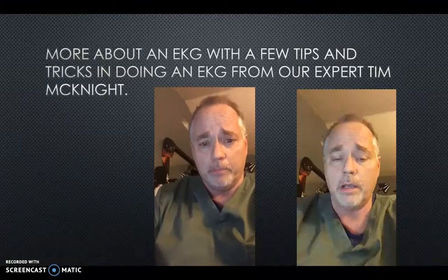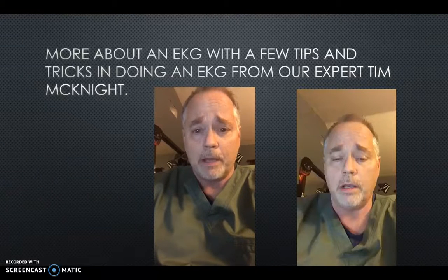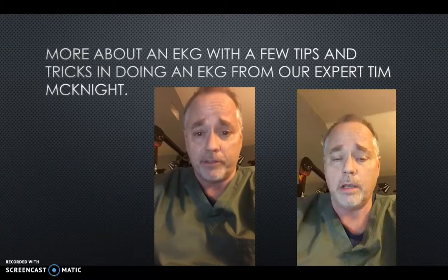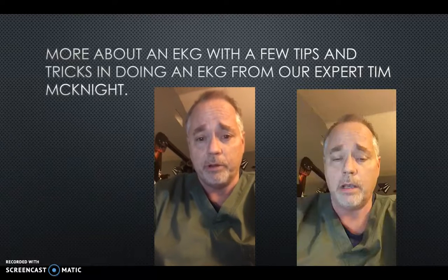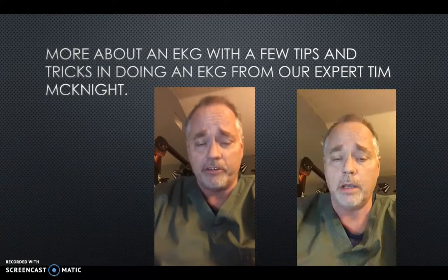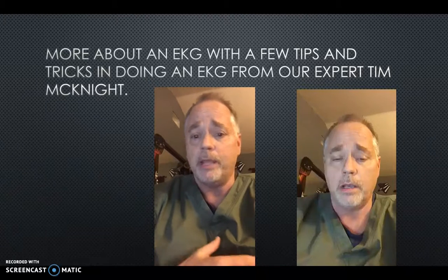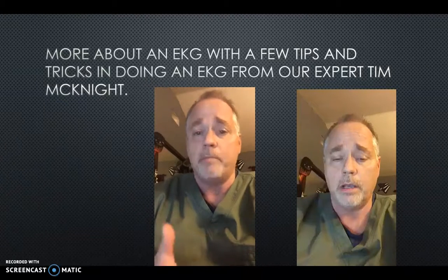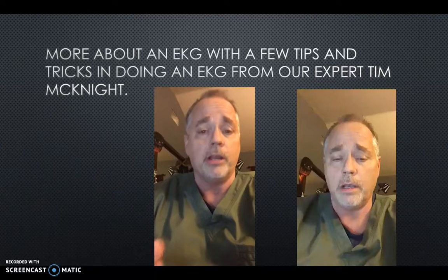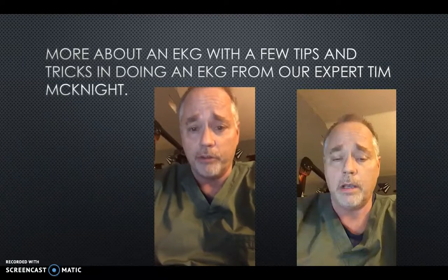A few of the important tips about an EKG: you want to have a patient that's ideally cooperative. That's always a bonus. But you want to explain the procedure to your patient. You explain what you're going to do, you explain the purpose of the exam, ask them if they have any questions prior to starting, and then explain step by step how we're going to do it.